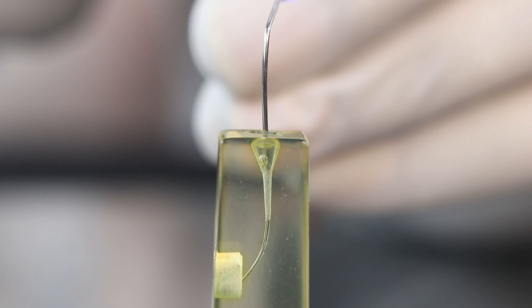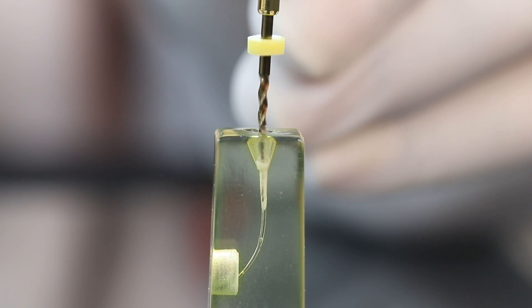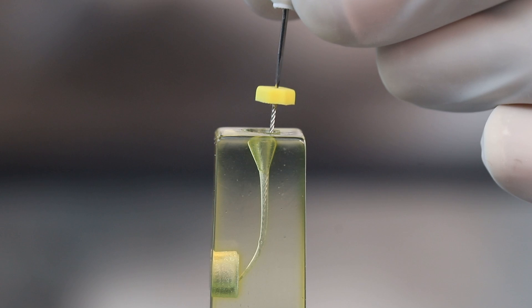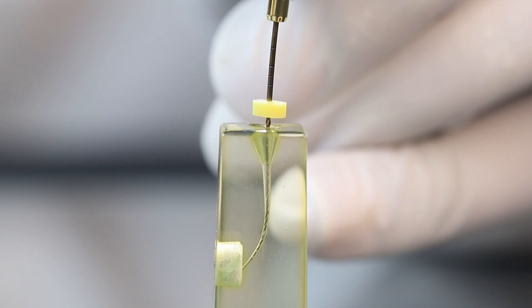Now we will irrigate this canal with sodium hypochlorite. If necessary, use the orifice opener in a brushing motion to create more coronal shape.